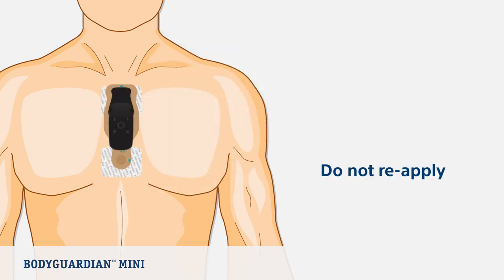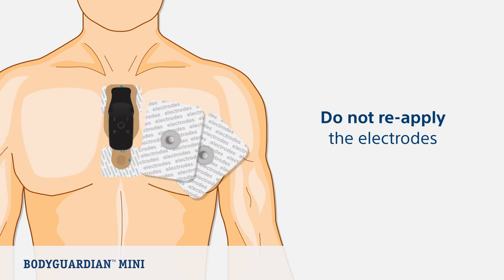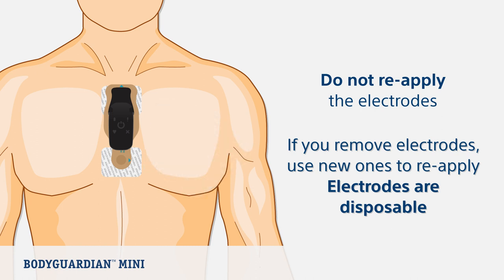Once the electrodes have been placed on the skin, the same electrodes should not be reapplied. In most cases, the adhesives will not restick sufficiently if you attempt to reapply the same electrodes. If you remove the electrodes for any reason, use new ones when you reapply. Electrodes are disposable.